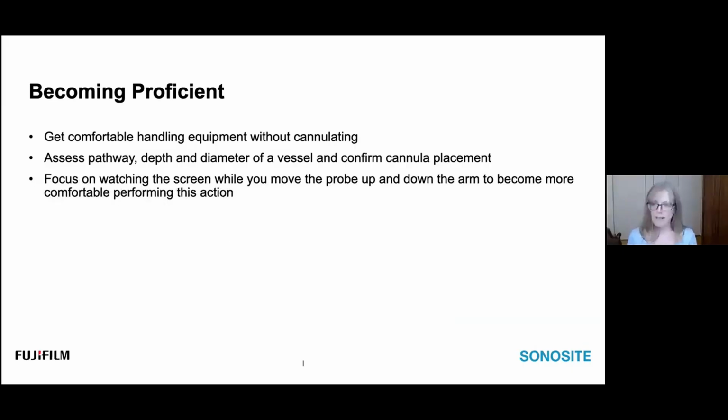But I do recommend, like I mentioned earlier, get comfortable with handling the equipment without cannulating at first. Use any type of simulation education that you can, Blue Phantom, a fake arm for cannulation, so that when you're getting used to how to hold the probe, you're not actually putting a live patient through that. You've got something that's simulated to use it. You can use the ultrasound to assess the pathway, the depth, and the diameter of the vessel to confirm cannula placement. So you can use the ultrasound after you've cannulated.